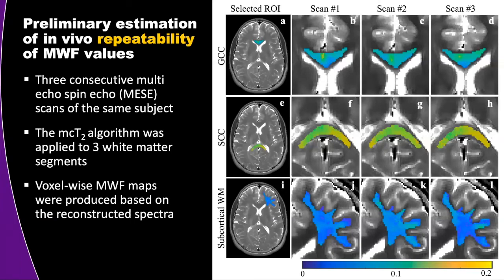Okay. And for the first part of the talk, you mentioned the way you compare your experimental data to the dictionary. Is there any particular metric you're using, or correlation? I tried several metrics like L2 norm, L1 norm, Frobenius norm. But to be honest, the L2 norm performed slightly better than the rest, and there was not a lot of difference. So the L2 norm difference is the most effective way.